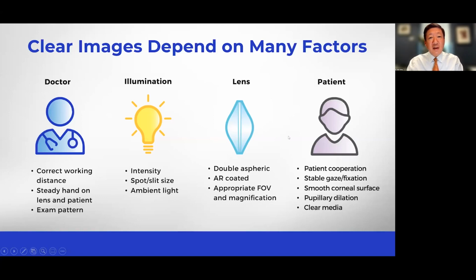And lastly, remember that it's uncomfortable for the patient. The patient may be fearful, or in the case of patients with ROP, they may even have bradycardia or stop breathing. So working with the patient, encouraging them, telling them that they're doing well is very, very important. You want to also be efficient. Lingering on the eye when the light is in your eye can be very uncomfortable. And we need to maintain that relationship in order to follow the patient over many years.